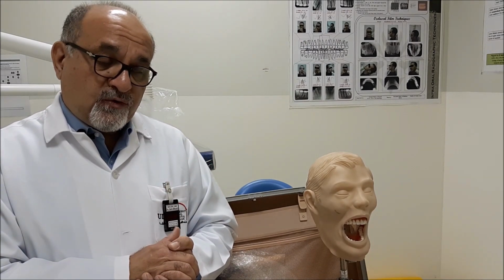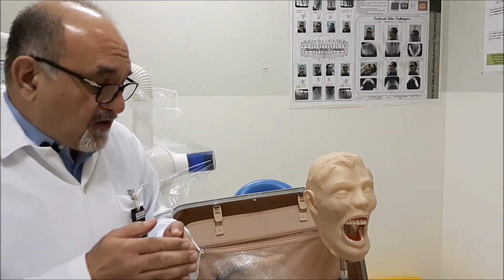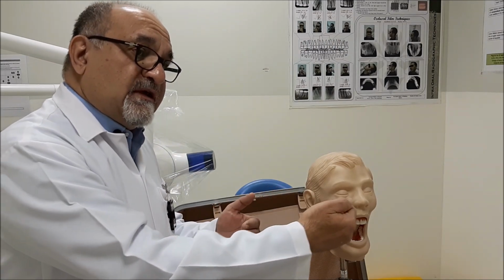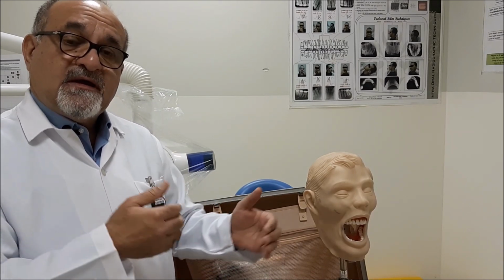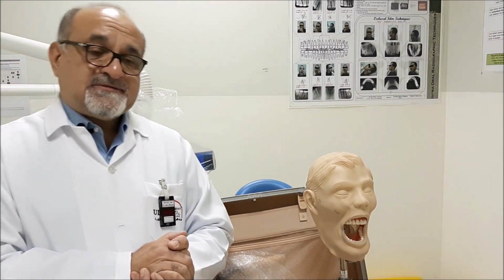So if we want to know the location, for instance, of a lesion, whether it is in a buccal direction, like in this case, or closer to the palatal or lingual position, or situated midway between the buccal and the palatal or lingual bones, it will be a bit difficult.